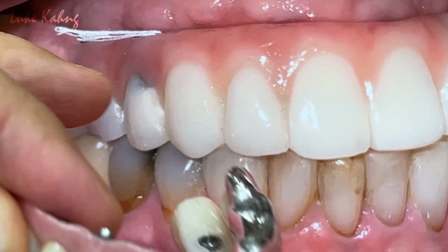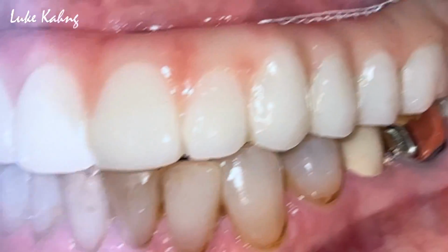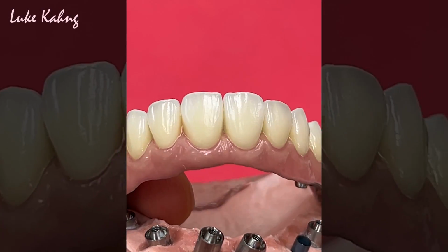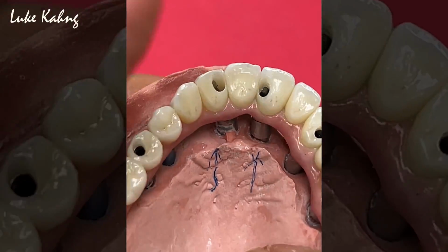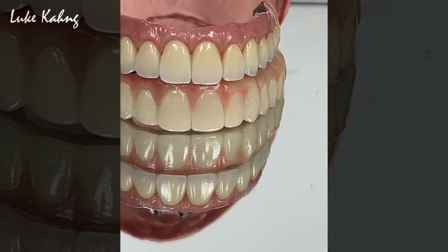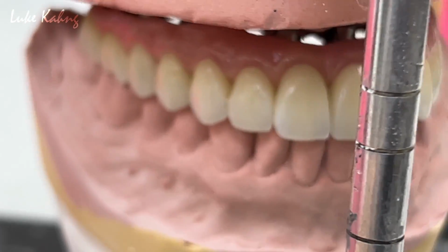This is PMMA from Trident, and here is PMMA. It's raised, okay, which is overlapping. And a better contour and shape, same as the other side too. Okay, so now it's great. Did it. The guard is finally done. Check the articulations, make sure they're all in contact.